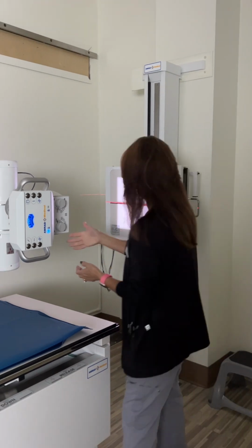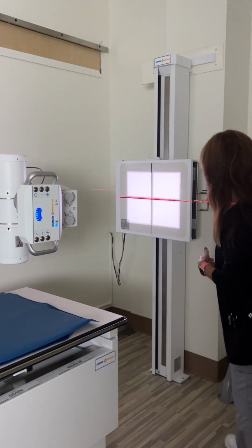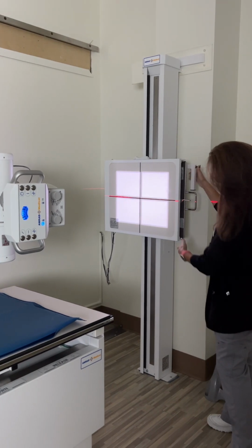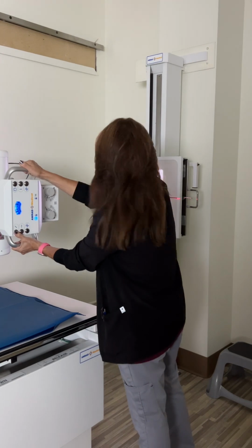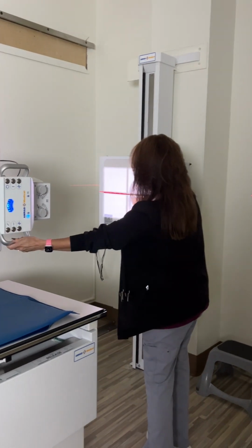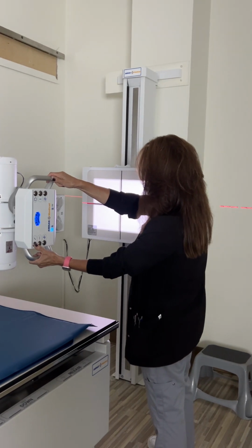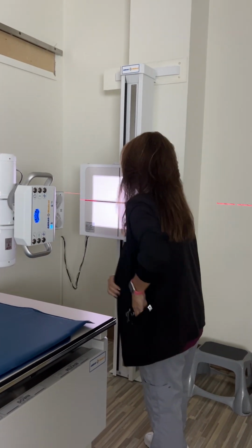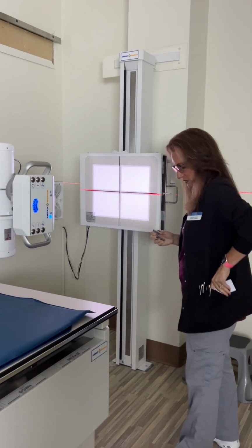And it's already set to crosswise. We're aligned with this, and we're in detent because we can tell. If we were not in detent, then this would not be aligned to the center of the wall bucky. So we want to make sure that we are in detent. I'm going to go ahead and place my marker before my patient comes up.